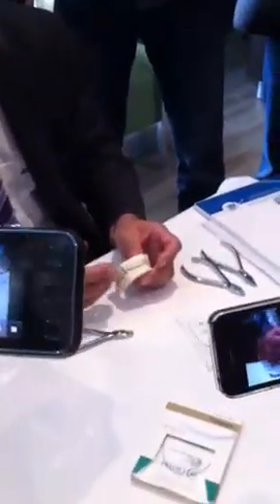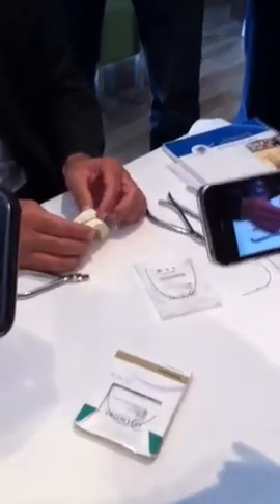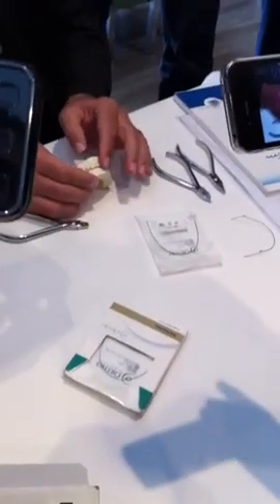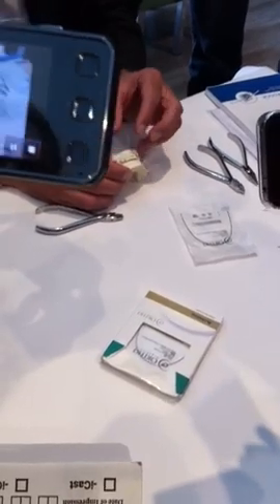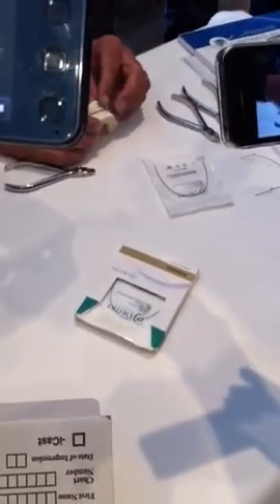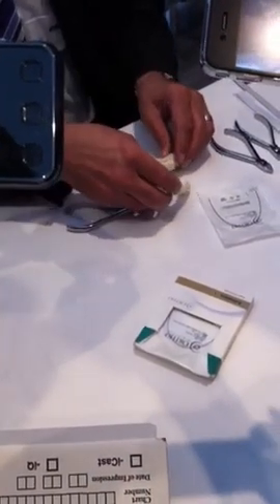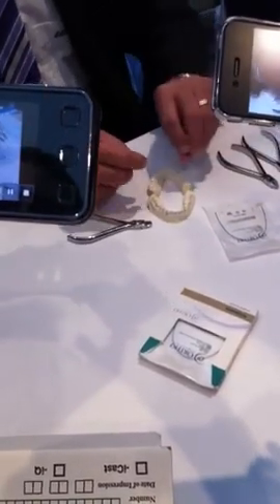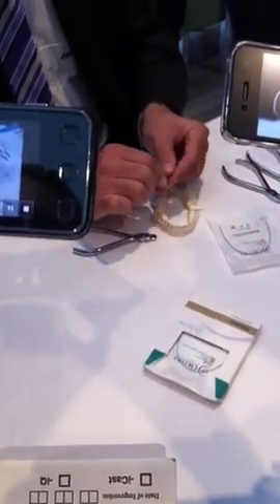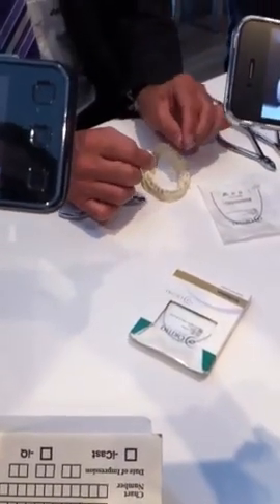We're going to discuss how we intrude incisors in a deep bite. In this particular case, we have a 100% complete bite almost to the palate. I want to intrude these incisors because this patient has a gummy smile, and by intruding we're reducing the gummy smile as well as preventing the upper and lower incisors from hitting the palate. One way of starting the case is using an intrusion arch. This intrusion arch can be easily bent, which is the purpose of this video. The technique was developed by Burstone and it's called a Burstone intrusion arch.